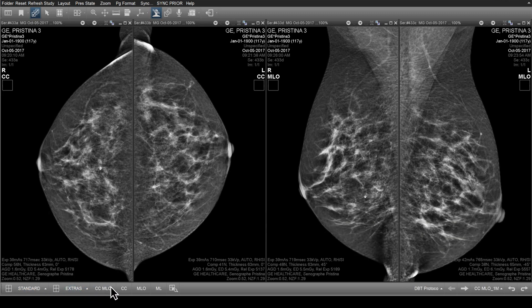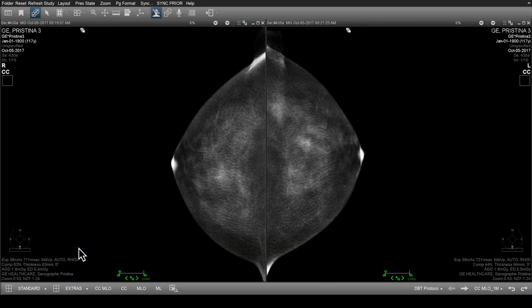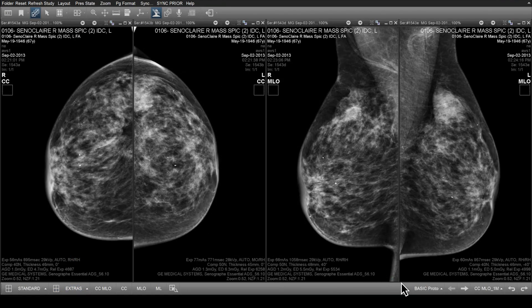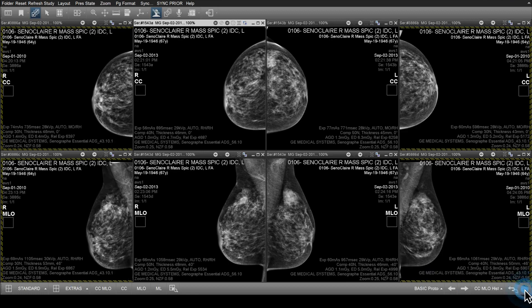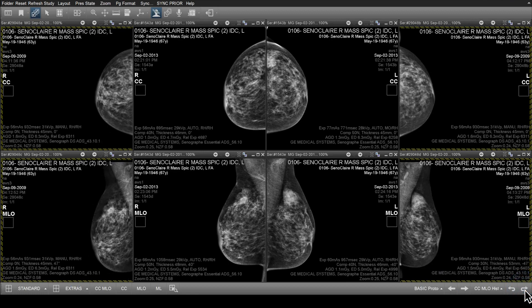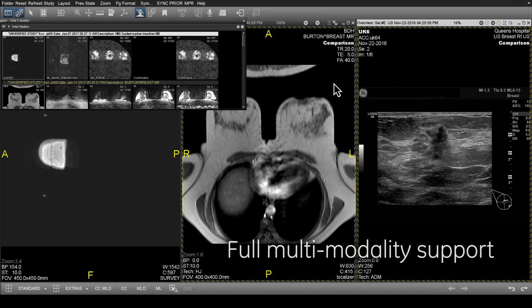For example, the CC, the MLO, or the CCMLO layout, or specific layouts that compare tomography images. Prior studies can be included in layouts and can be quickly cycled through for comparison to the primary study. If desired, custom layouts automatically load breast ultrasound and MRI images for comparison.